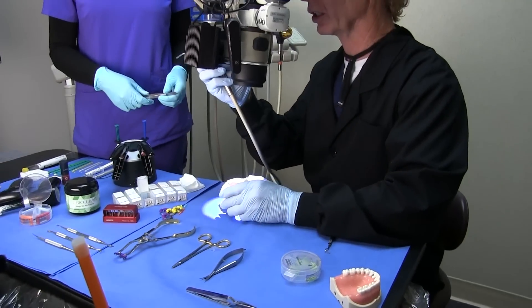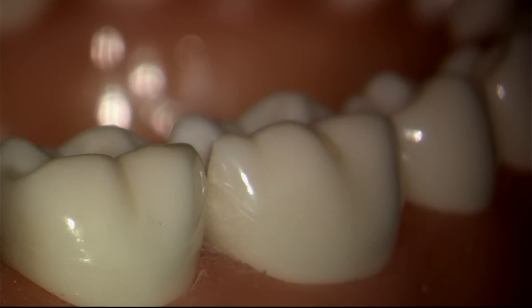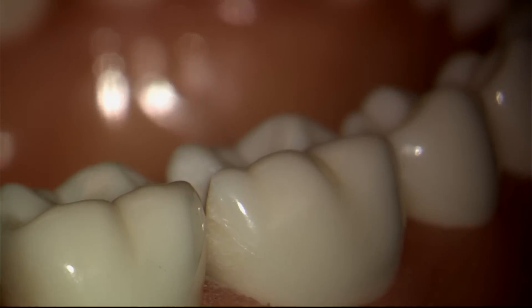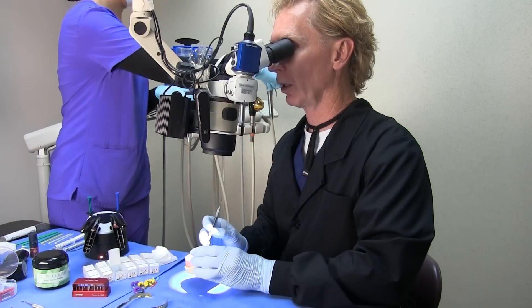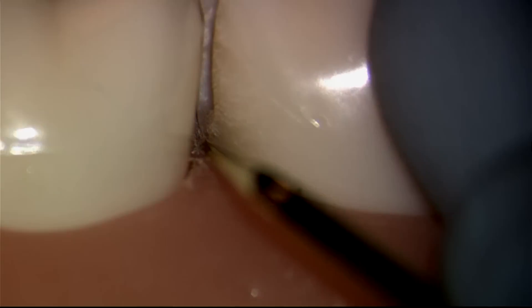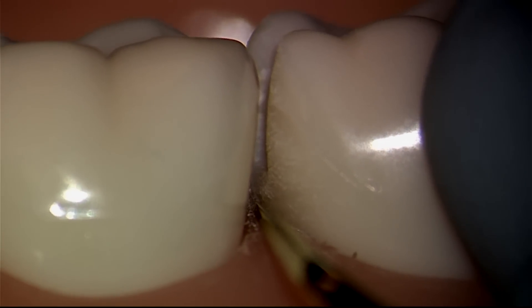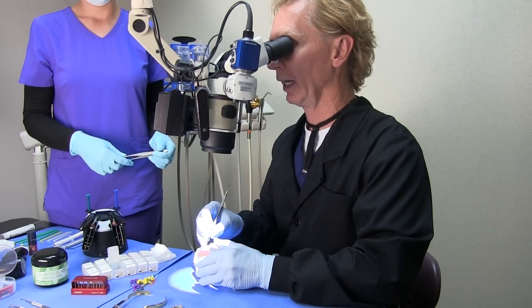You'll notice that the entire surface is now sanded all the way to the line angle. So now as we do our injection molding, we're going to allow the matrix and the composite to truly wrap the tooth and engage all of that enamel, and especially the enamel at the gingival.